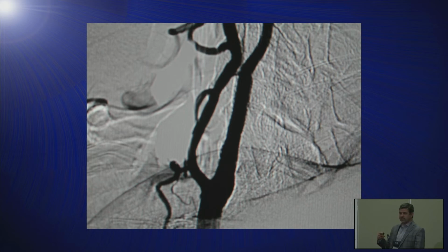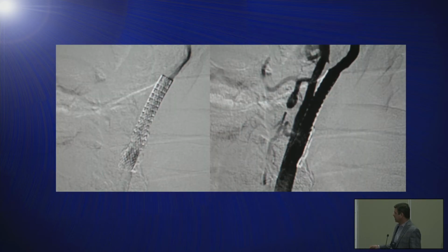So the little filters can cause distal dissection, so there's something to think about. The edge of the stent there can be a dissection here, especially if there's been an angioplasty. So as you're inserting these devices, you're looking for those kind of problems.